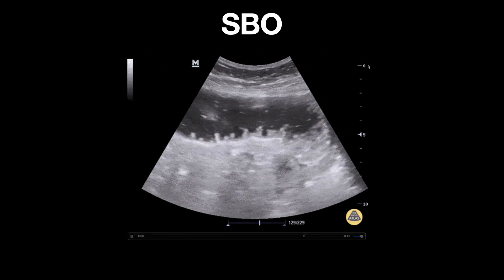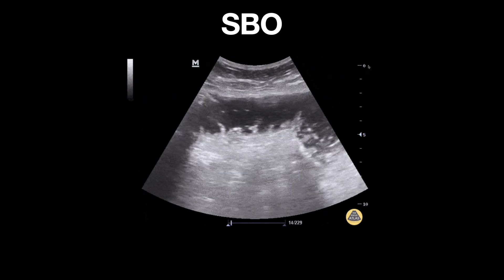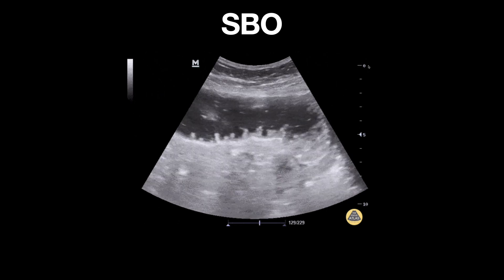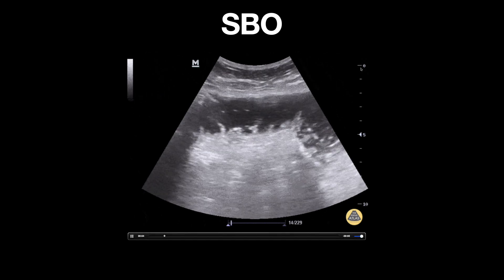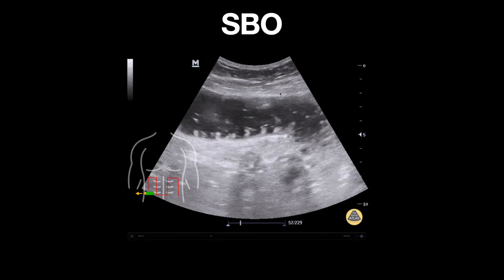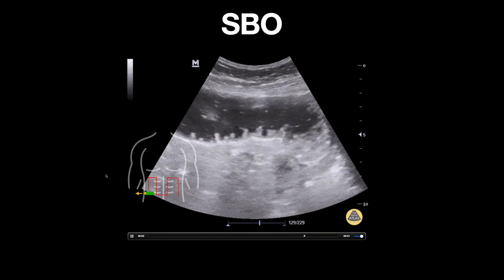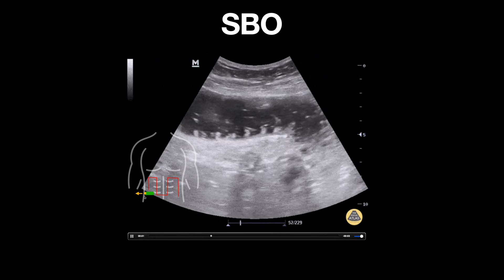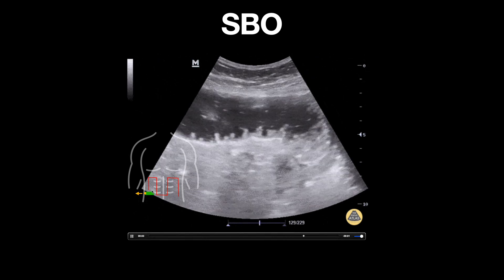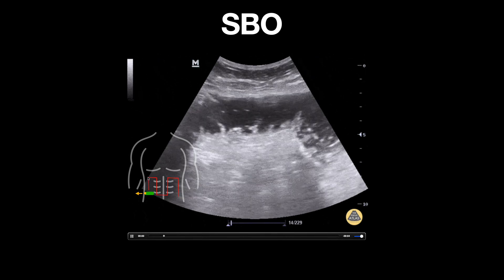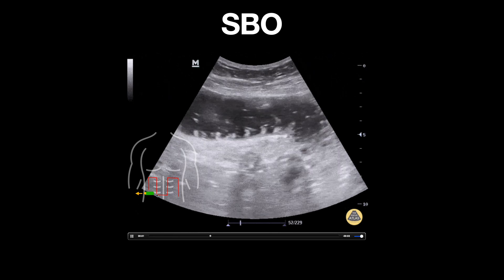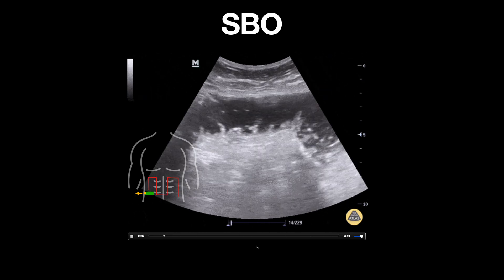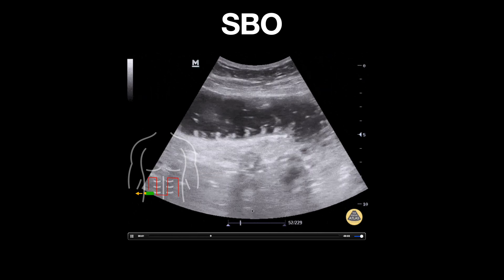This is an ultrasound clip demonstrating findings of a small bowel obstruction. A curvilinear probe is used and placed over the abdominal wall. Generally, when performing this examination, the probe can be placed in a transverse orientation and moved in a lawn mower-like, organized fashion across the abdominal wall, evaluating for dilated loops of bowel.